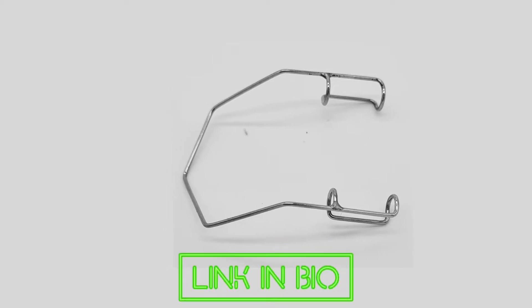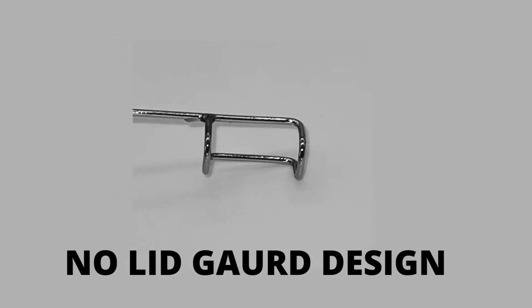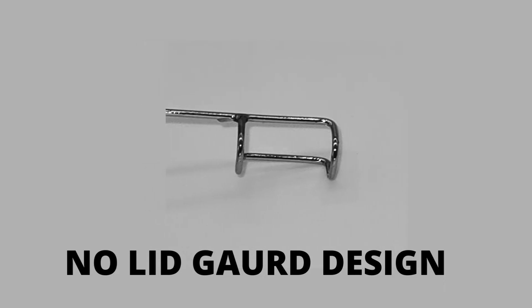Wire-eye speculum is a surgical instrument used during various ophthalmological surgeries and procedures. The absence of lid guards on the wire-eye speculum provides easy and wide opening of eyelids with a fully exposed lid margin during surgery.